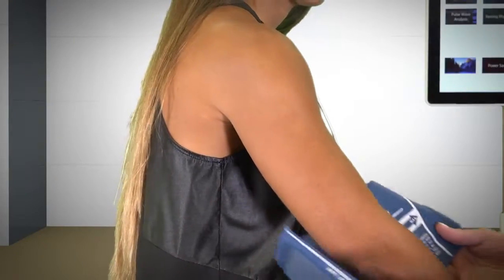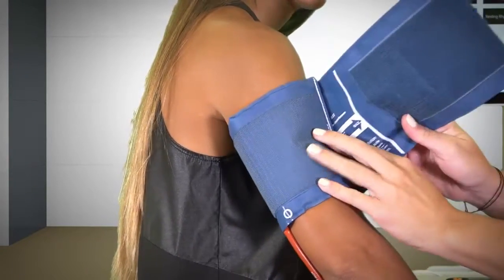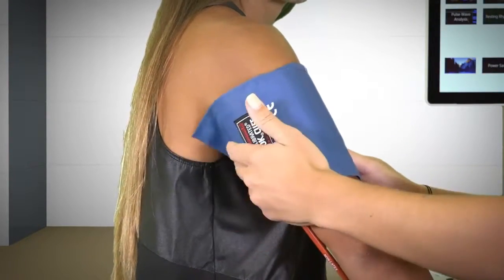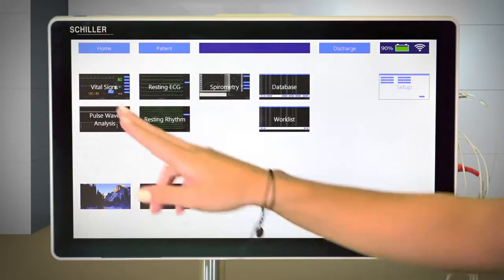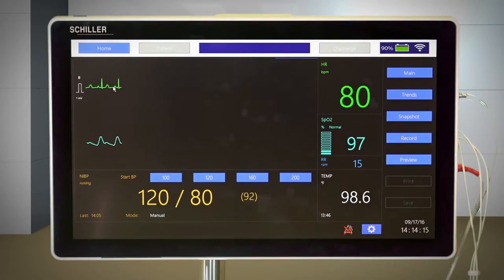By connecting only three electrodes, and without the need to address the patient, it is possible to quickly display one ECG channel, enough for arrhythmia and atrial fibrillation screening.